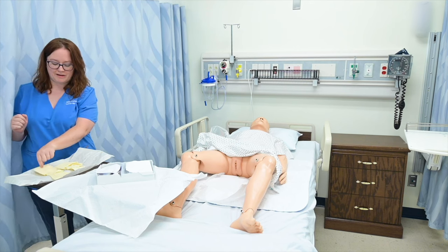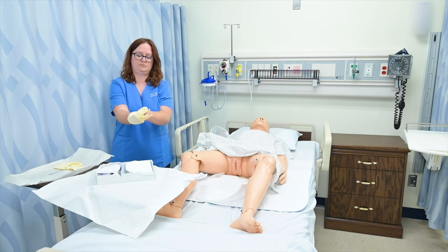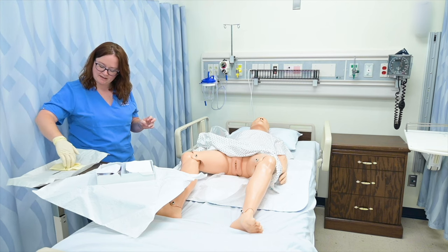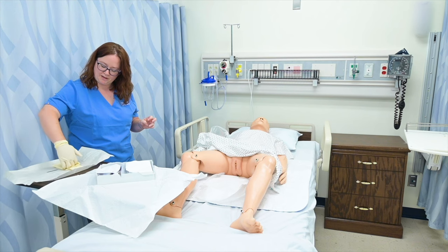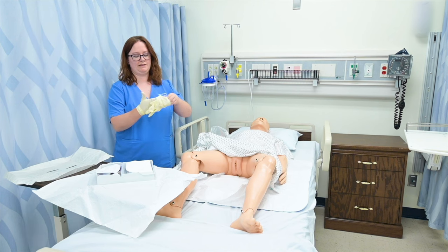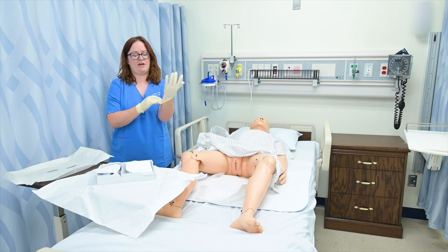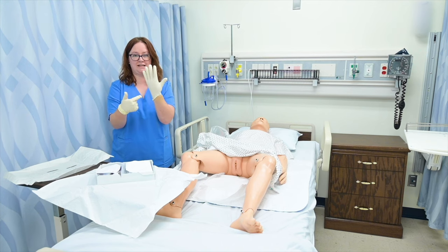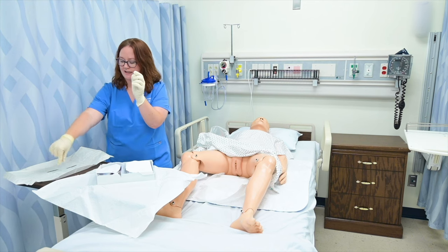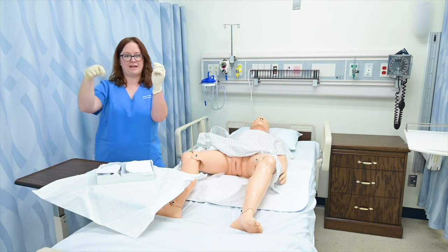I'm going to pick up my dominant cuff with my non-dominant hand. Then using my fingers of my dominant hand, I'm going to scoop up my non-dominant cuff, keeping my thumb out and roll it on. I can't fix the rolling part because it's already touched my skin — that's just how they go on. Then I can move this, touch it from the center, and discard it in the trash without dropping my hands below my waist.